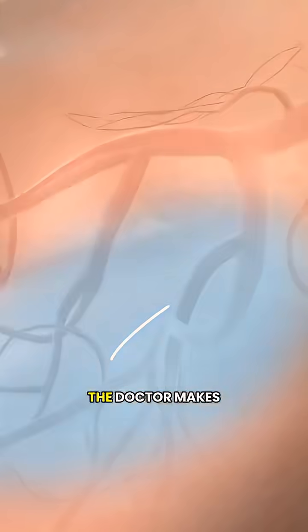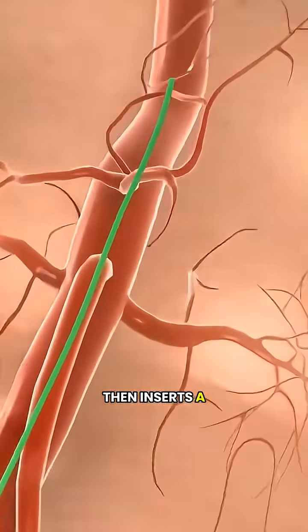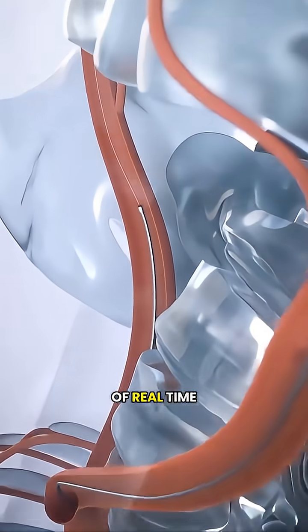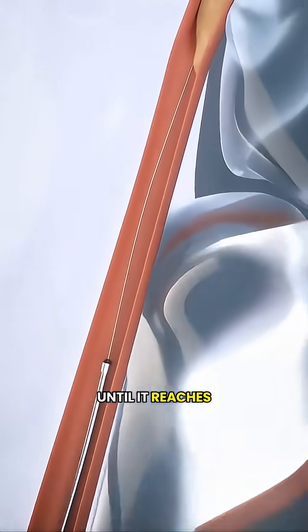At the start of the procedure, the doctor makes a small entry point in the wrist or groin, then inserts a thin catheter. With the help of real-time x-ray imaging, the catheter is guided through the blood vessels until it reaches the blocked area.